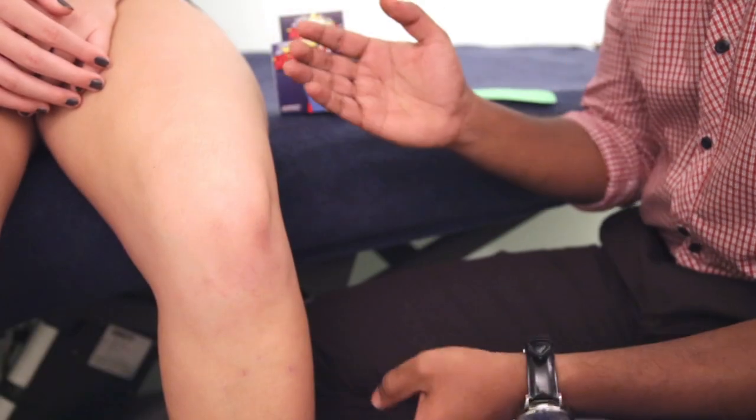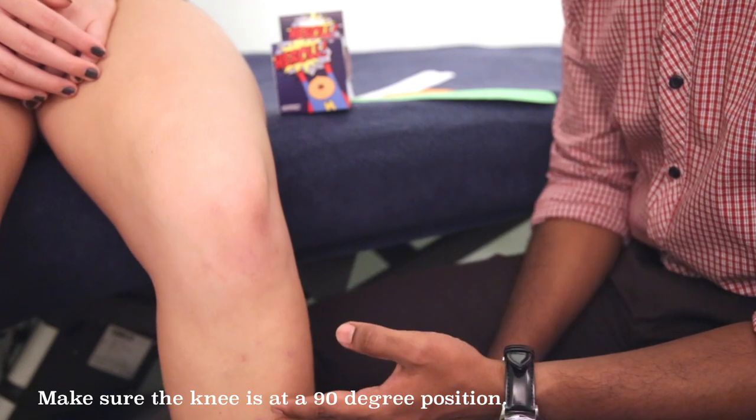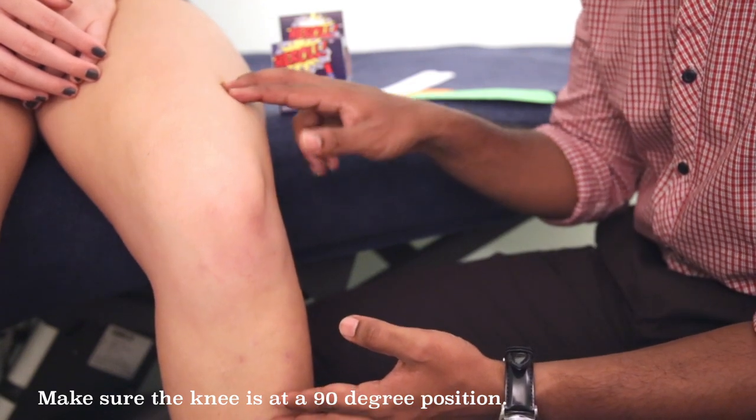Before we start applying the tape, make sure Sarah's knee is in a 90-degree position. This allows the quadriceps to be nicely lengthened and relaxed.